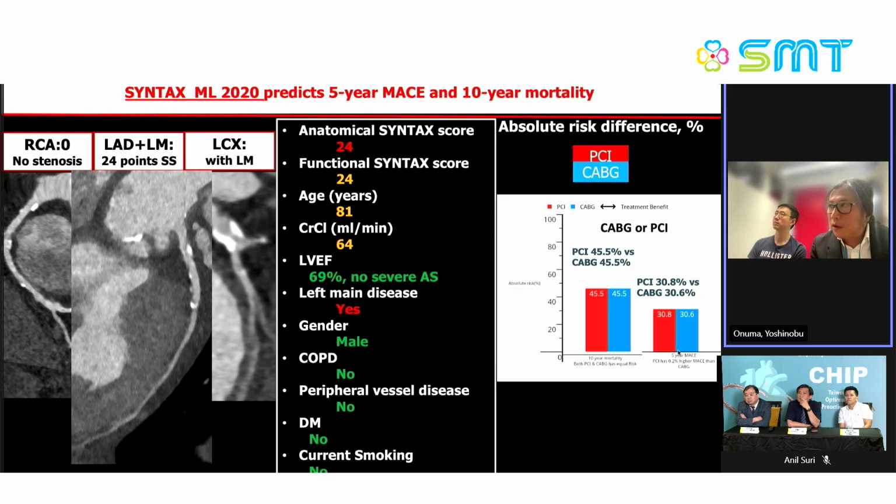And after looking at the anatomy, the heart team decided to refer the patient to PCI because it's somewhat calcified, but simple enough for the treatment of the PCI. And for the 81 years old patient with the aortic stenosis, not yet the indication of the valve, they tried to preserve the option of the surgical revascularization and the valve intervention.